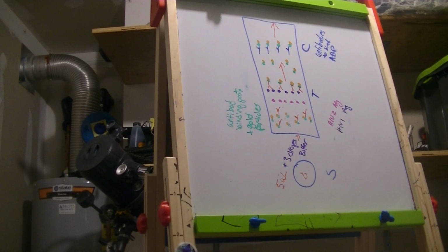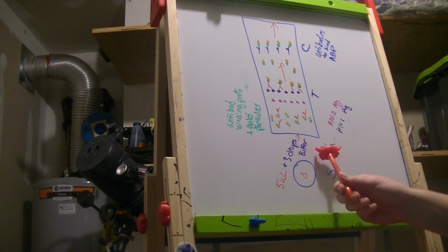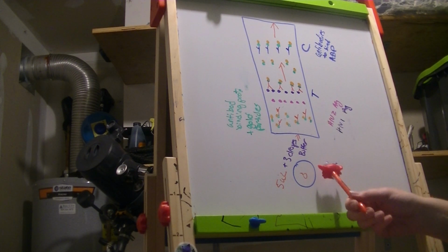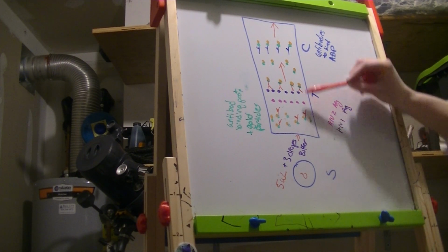This is the explanation for the principle on the HIV 1 and 2 test procedure we performed in lab. So if you remember, we took 5 microliters of patient sample, and to that we had to add 3 drops of running buffer to push the sample through the test system. So the sample traveled from the bottom toward the top.